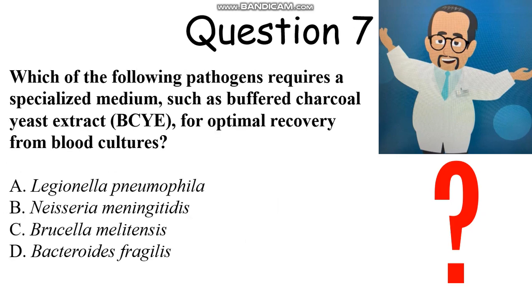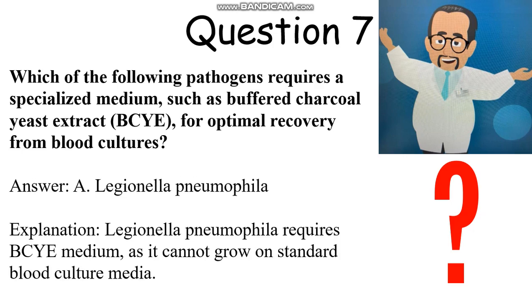Next question, which of the following pathogens requires a specialized medium such as BCYE for optimal recovery from blood cultures? Is it Legionella, Neisseria, Brucella, or Bacteroides? Legionella. Legionella requires BCYE medium because this organism cannot grow on standard blood agar medium.